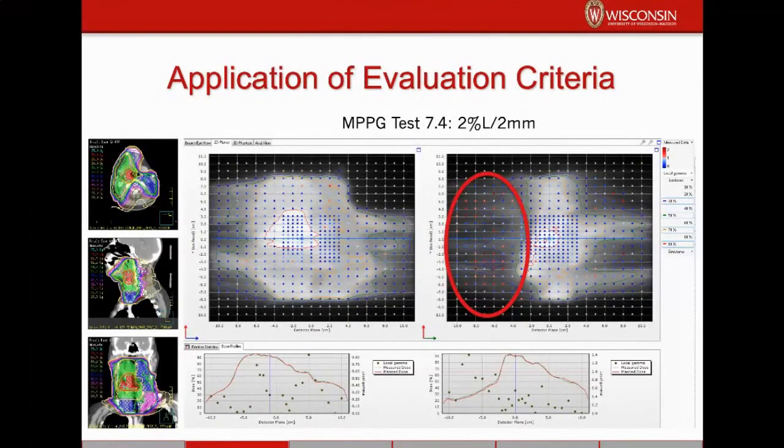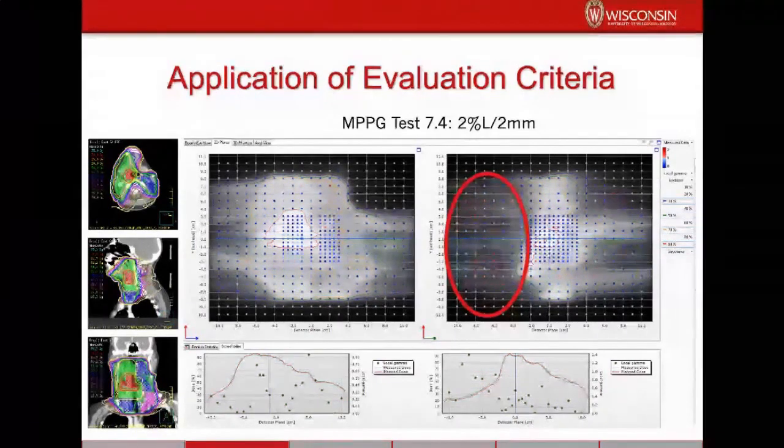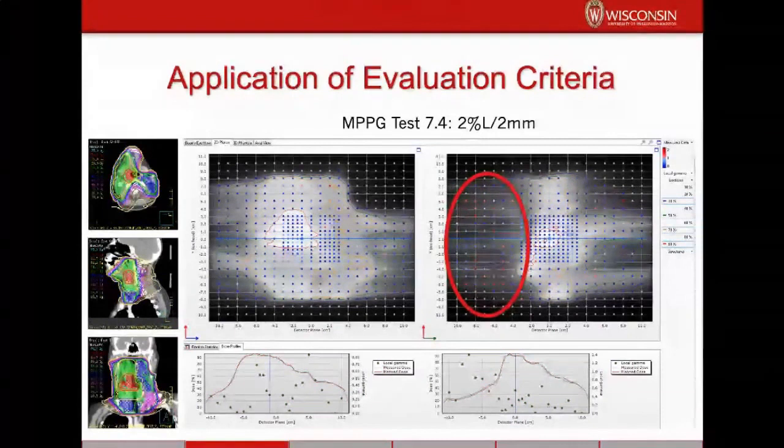And really, tests like that belong to situations where you're commissioning a treatment planning system that might be custom made or really, really new, such that nobody out there before has ever really checked into these things. But if you're doing a simple treatment planning system upgrade from a well-known vendor who's been making treatment planning systems for a long time, very often you won't go through the entire TG53 process.